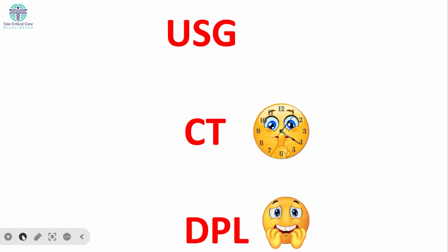Of course, it is not as sensitive as those two, CT and DPL. DPL can detect as little as 20 ml of blood. CT can detect 100 ml of blood, and sonography, depending upon the size of the body, can detect around 200 to 600 ml of blood. But still, sonography is the gold standard when it comes to bedside imaging for evaluation of the trauma patient.